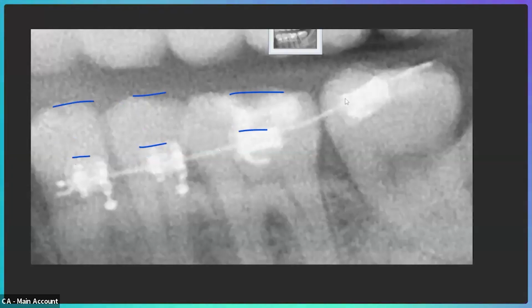What we do here is we actually cheat the bracket to be at an angle relative to the occlusal surface. The reason why is that we actually want the wire to bind in the slot here and here slightly and kick the root to the mesial. So we're cheating this more upright. We're not going to go vertical on it, but we're kind of going halfway between vertical and horizontal with our positioning.